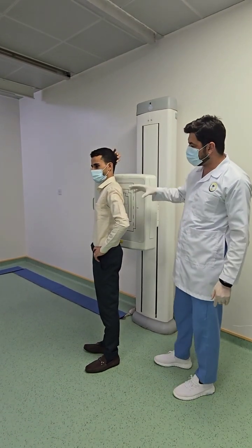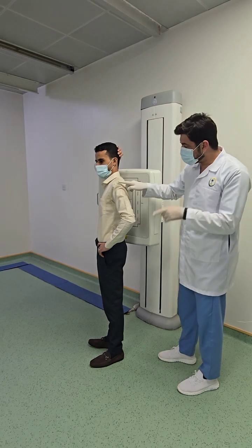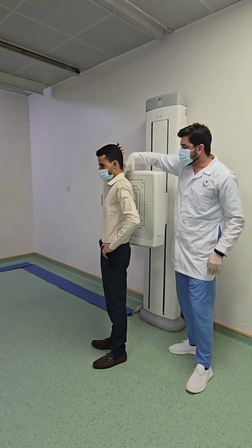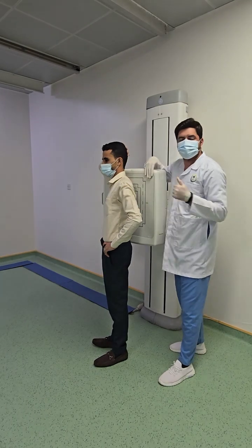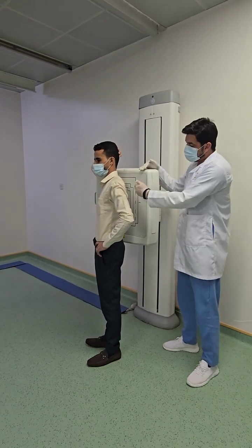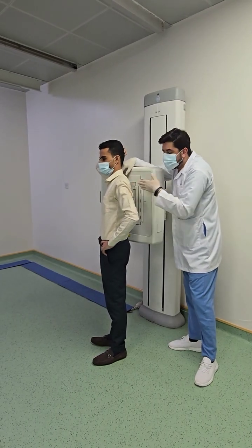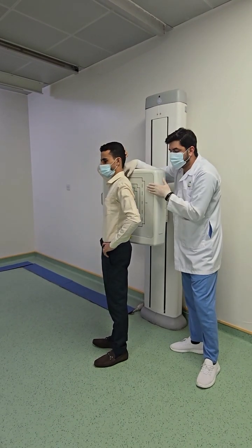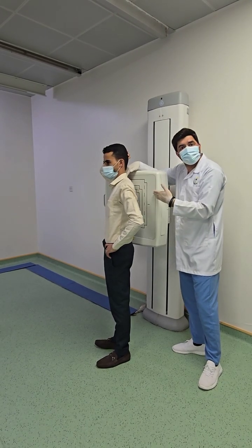Now we will look over here at which side of the body is attached to the detector. Left side or right side. So the right side is attached to the detector and the left side is far away from the detector. So we will take the side which is attached to the detector first. Posterior, right side attached, and this is at some angle. So this is right posterior oblique.